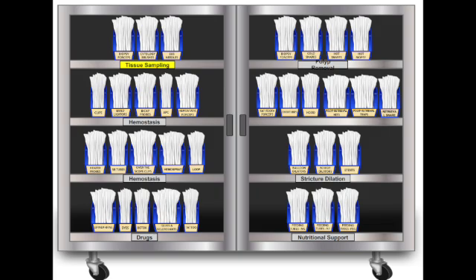They can be used to bridge leaks, maybe after surgery, anastomotic leaks, or to seal perforations that haven't closed with clips. They're essential for draining fluid collections, like pancreatic pseudocysts, by stenting internally between the collection and the stomach or duodenum. And facilitating procedures. Yes, that's a newer application.